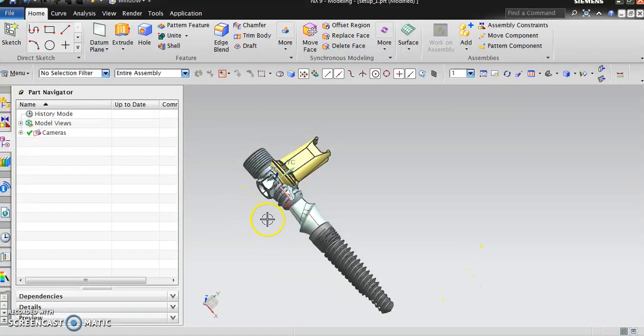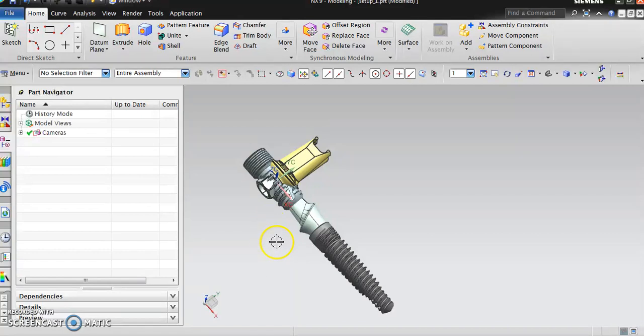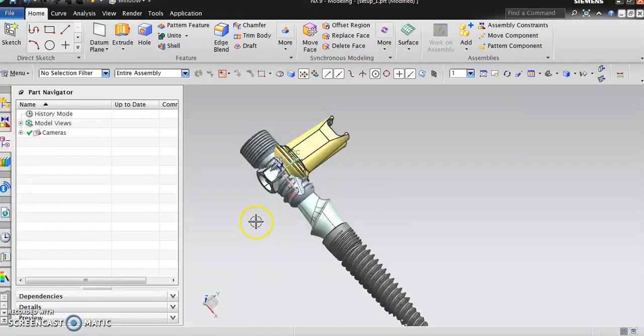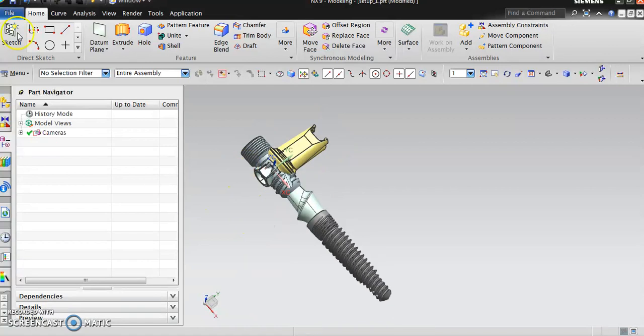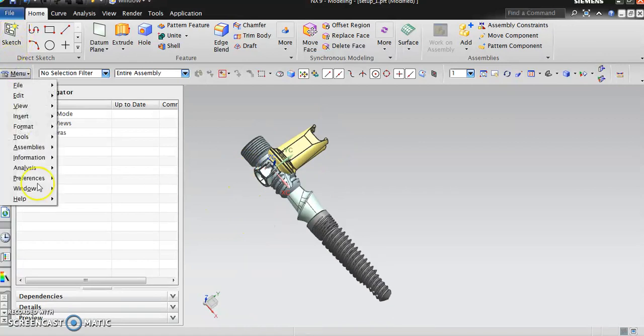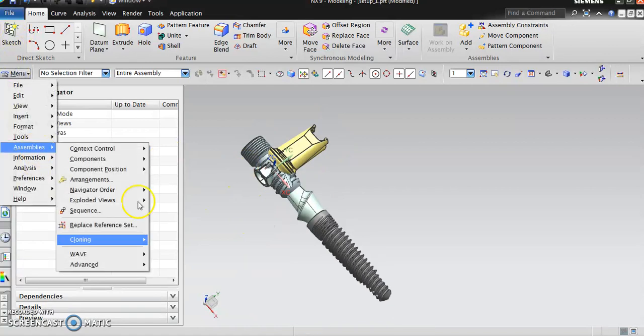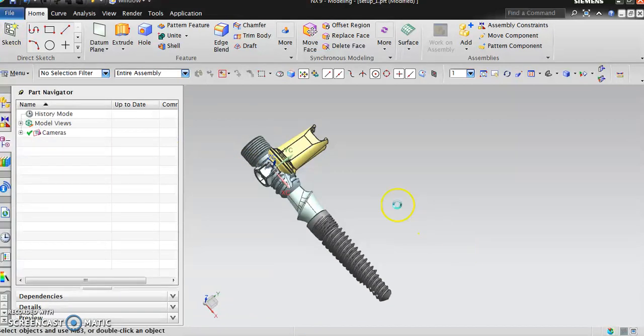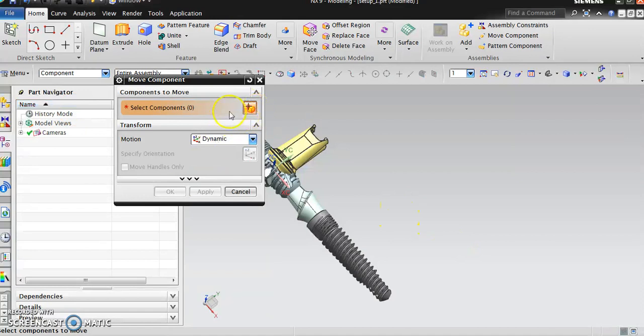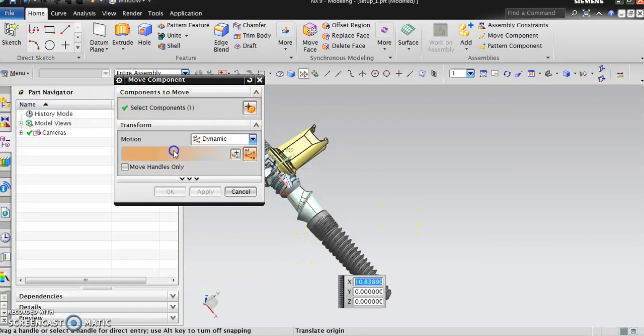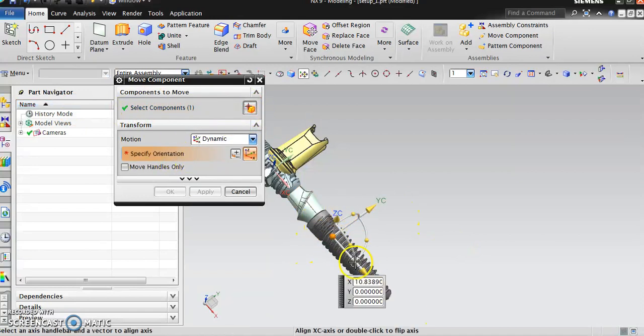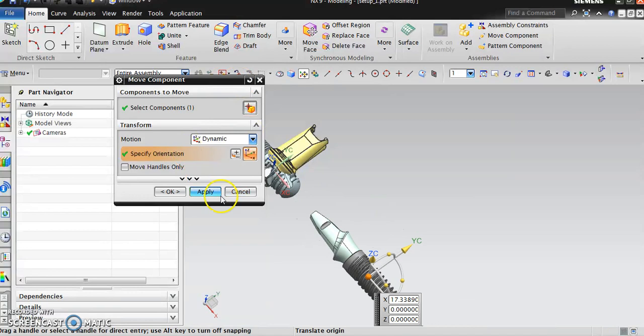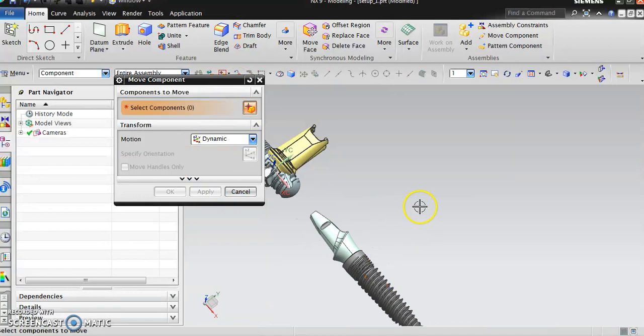As a backup to this video, I put in a machining video that will go through the complete machining solutions for each one of those products. You can see four different components on the screen. Let me go back into my assembly and move these components so you can see the different components.